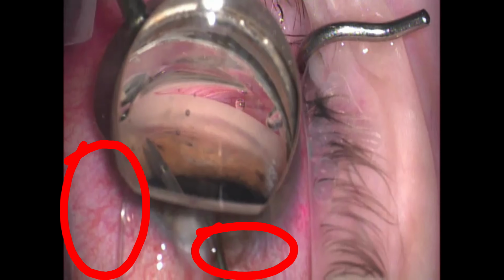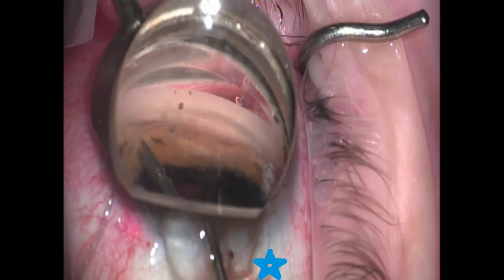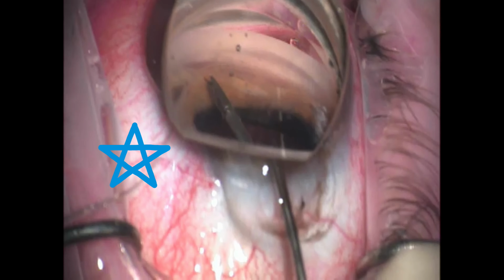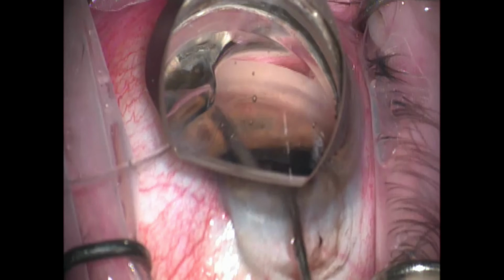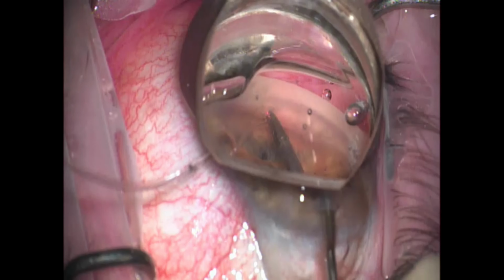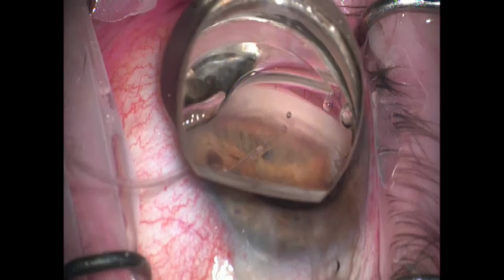Now pay attention to the two areas circled in red. As I'm going around, I'm having my assistant click or inject small amounts of viscoelastic. My goal is usually to get somewhere between 30 and 50 clicks per treatment. Those two areas that you're seeing in the blue are areas where you can see the eye has gone from red to white, and that is demonstrating the pushing force of that viscoelastic or canaloplasty down through the distal collector channel. You're seeing the blood go away because the viscoelastic has taken its place. So we're 360 degrees around with the catheter.